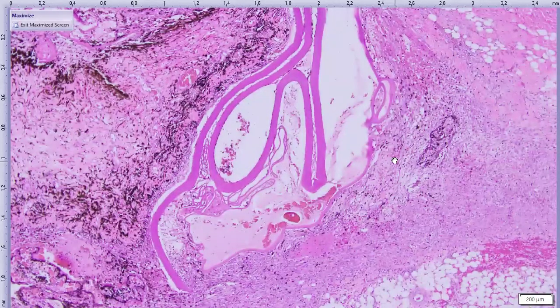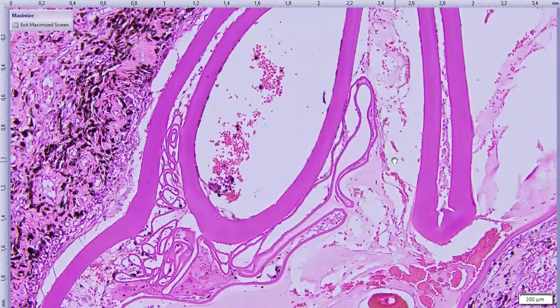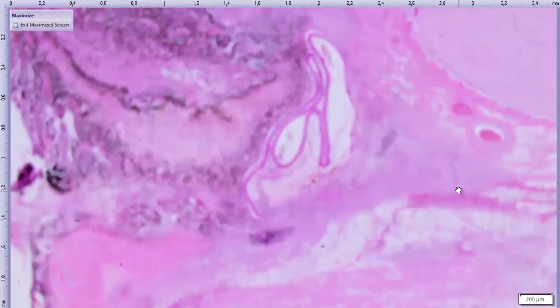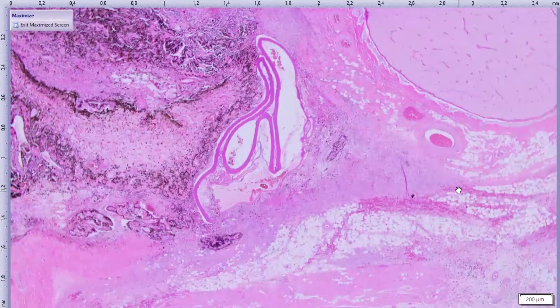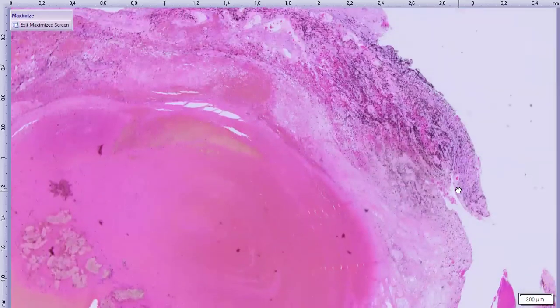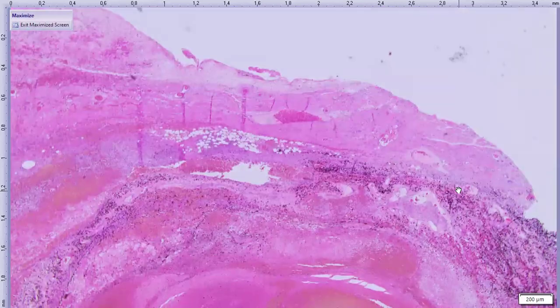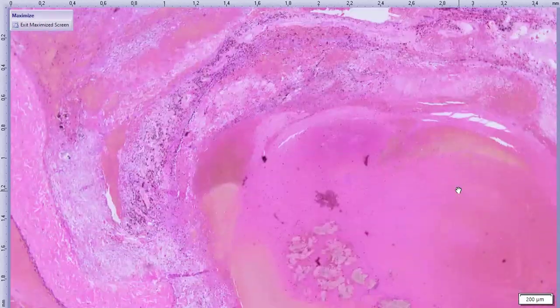In the deeper section, it's quite thick, too thick for Descemet's membrane. You can see that we have one part that's quite thick, and then we have one part that's quite thin. It's all convoluted, so that's good for lens capsule. So the lens was extruded into the orbital space as well. We did not sample the optic nerve in this section, and we didn't actually sample any more of the lens material. So hopefully it's not still in the orbit because it's quite antigenic. But anyway, that is a nice example of posterior rupture.